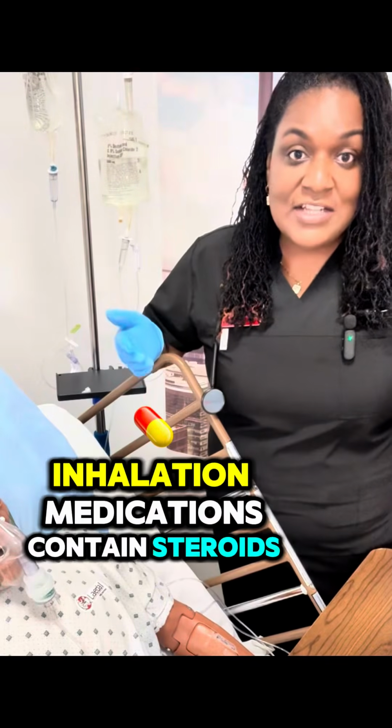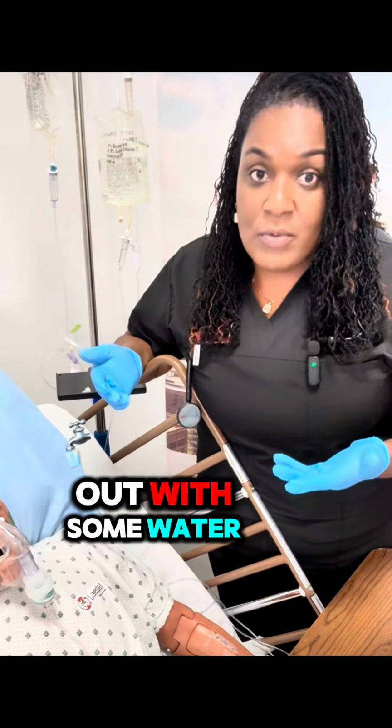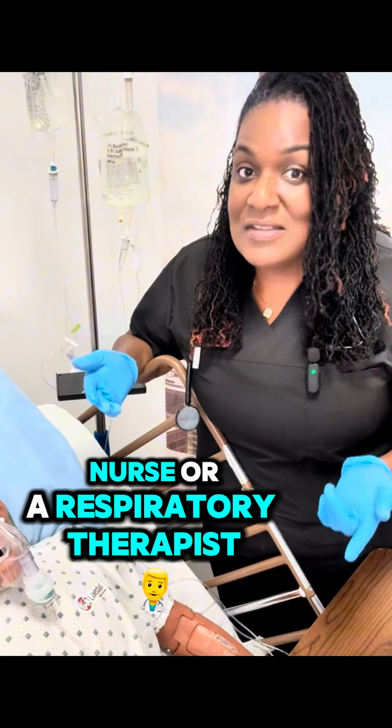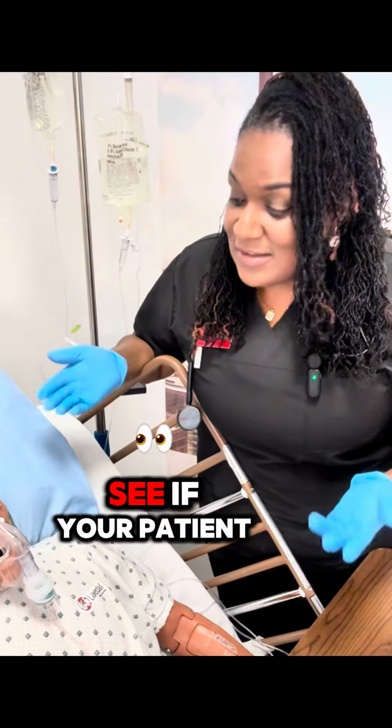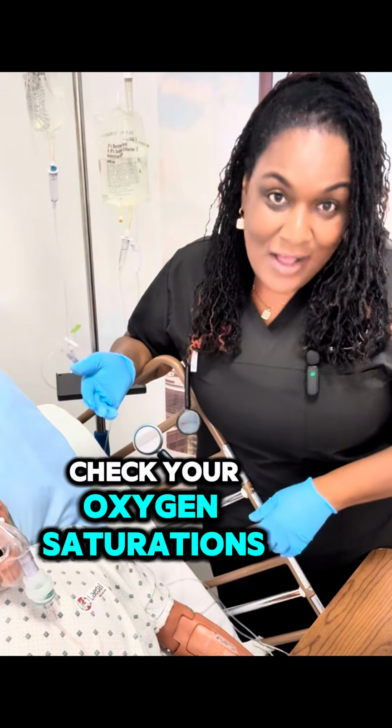Because some of the inhalation medications contain steroids, your patient may need to rinse their mouth out with some water. They may need to brush their teeth. But if you're a nurse or a therapist, go back and listen to the lung sounds. See if your patient sounds better. And of course, if you have a pulse ox, check your oxygen saturations.